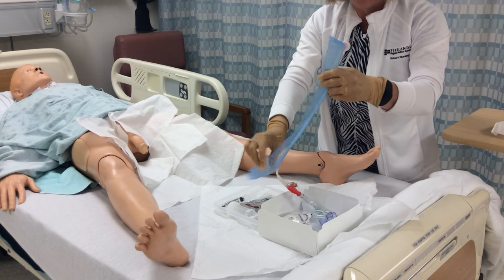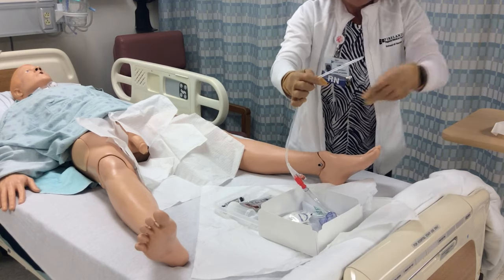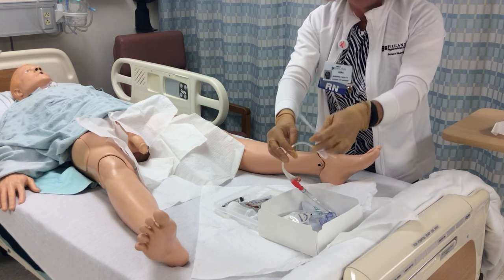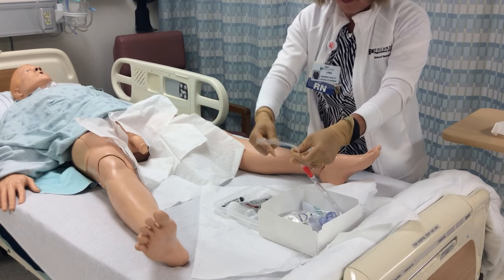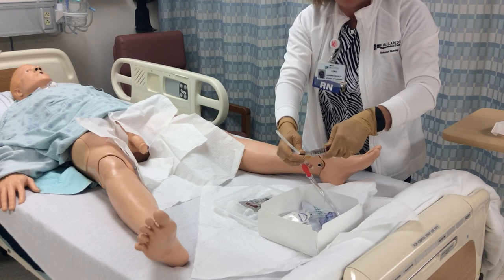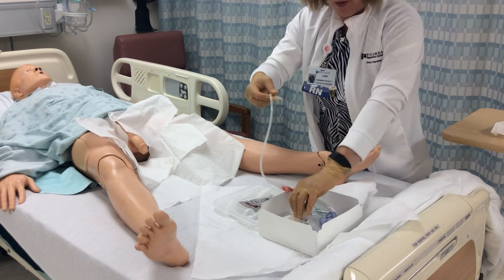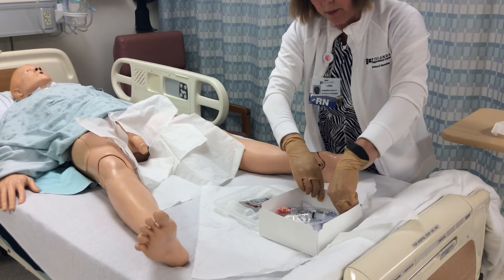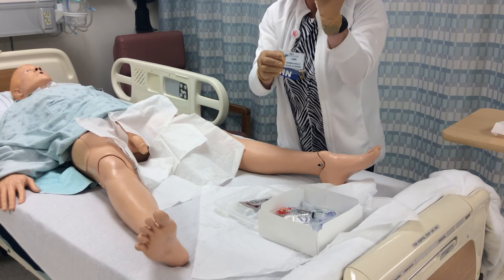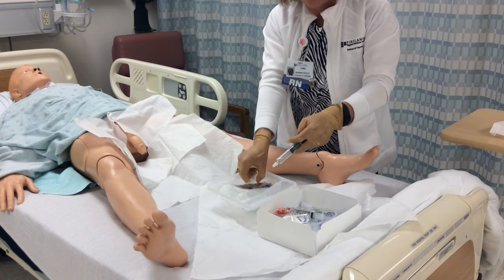Remove the covering of the catheter and place it in the trash, being careful that the catheter is not flailing around. Take the syringe full of sterile water and connect it to the balloon port of the catheter, then place it back in the packaging, making sure the bag is clamped. Squirt the lubricating gel into the inner portion of the tray.